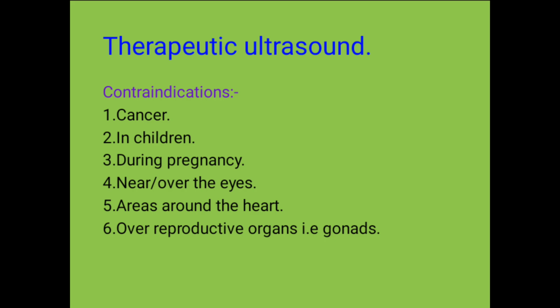Therapeutic ultrasound is also contraindicated in children because it will affect the epiphyseal plate. Those are the growth points of bone, and if they are affected, there might be a problem in the bones, even making a child highly susceptible to fractures.